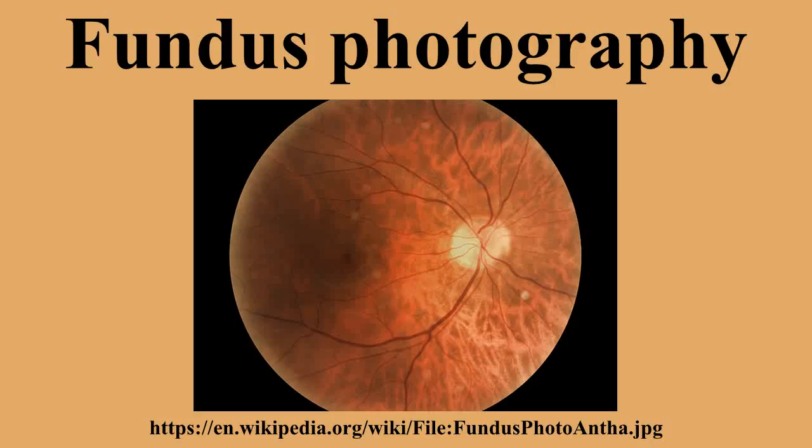Future advancements. Fundus photography has been crucial in diagnosing and treating patients in ophthalmology since the 1920s. Fluorescein angiography has been crucial to ophthalmology since the late 1950s, while OCT imaging has helped reduce the need for fundus photography and fluorescein angiography. Nothing has been implemented that can replace these very important diagnostic tests.